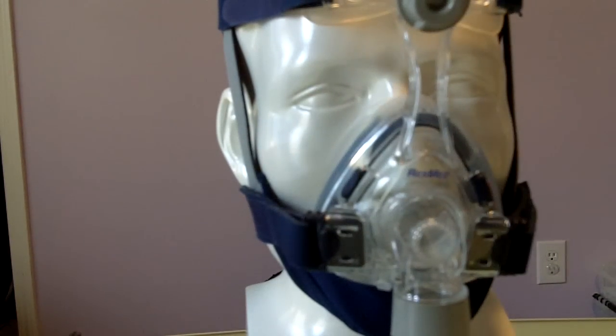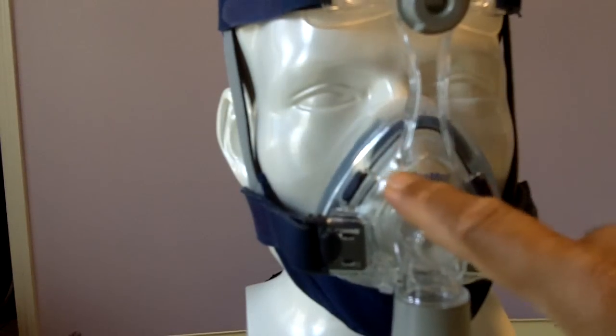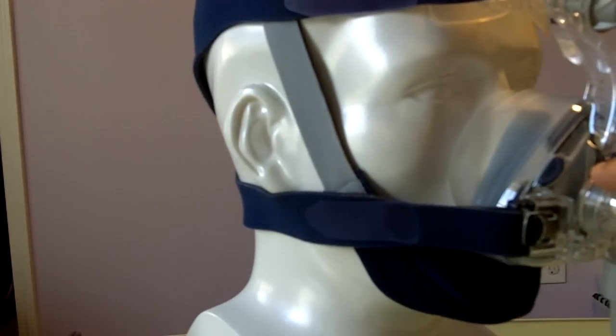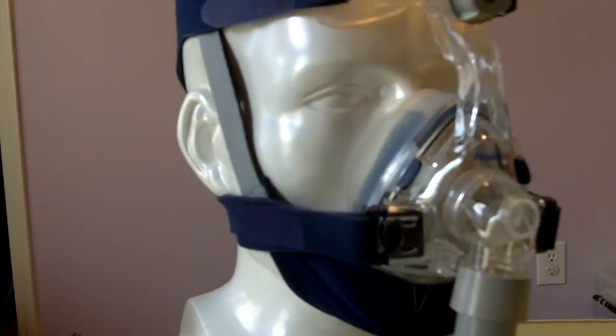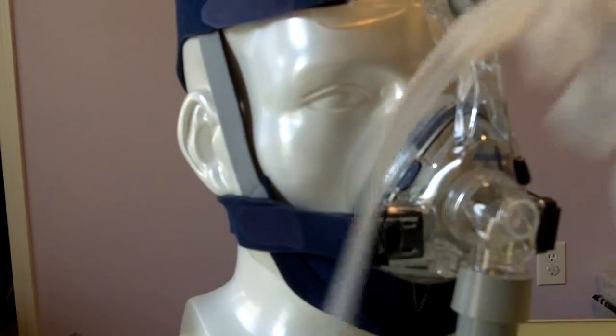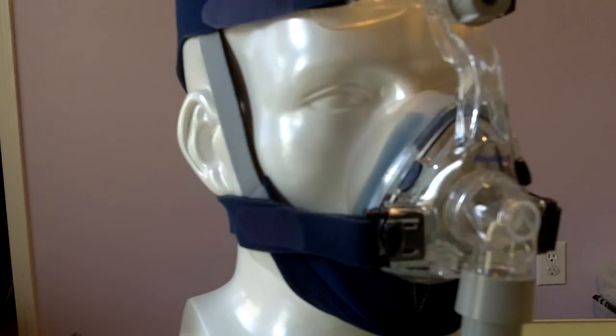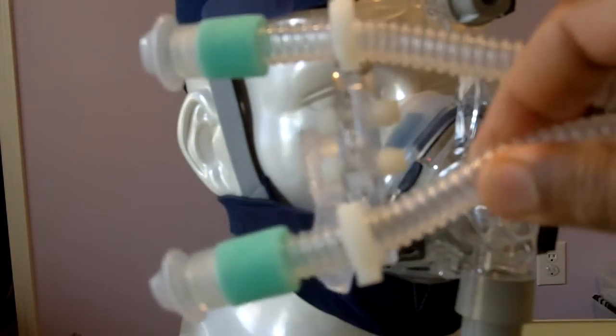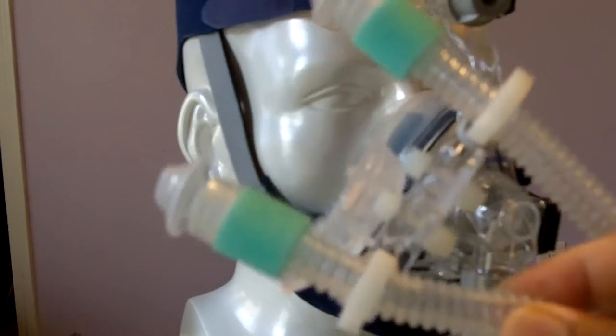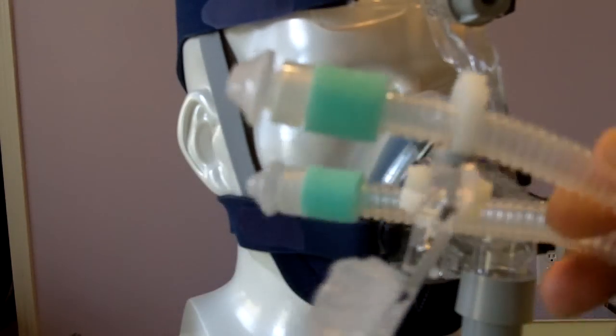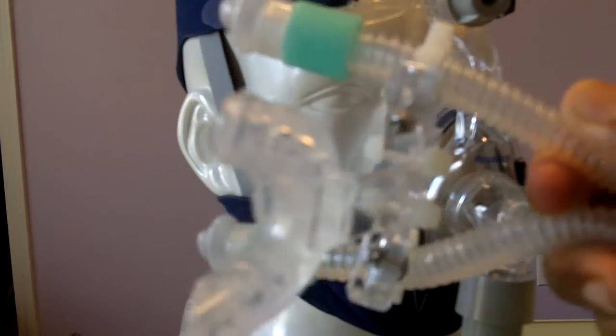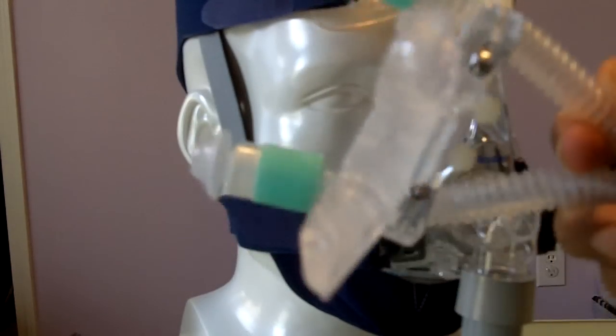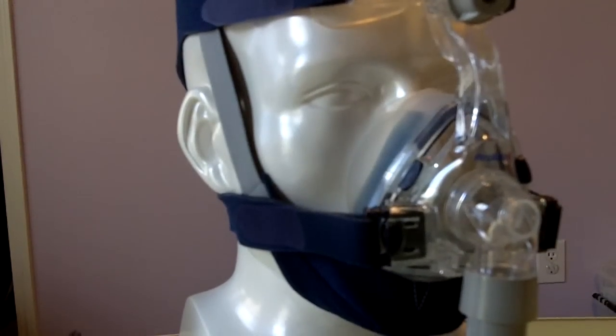You can use this chin strap with a nasal mask that just covers the nose, nasal pillows, or even the famous CPAP Pro no mask system which doesn't have a headgear. Drop by the website to see the review.